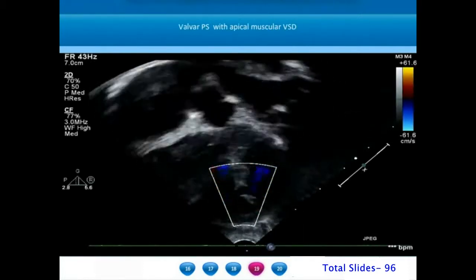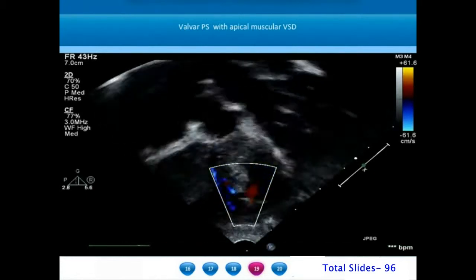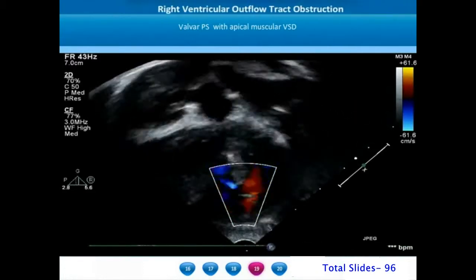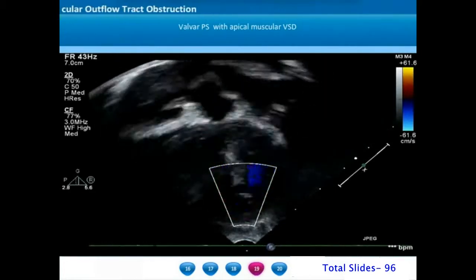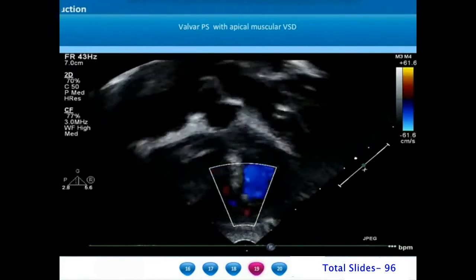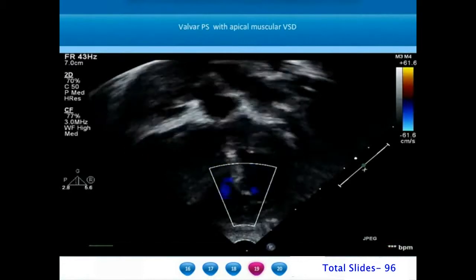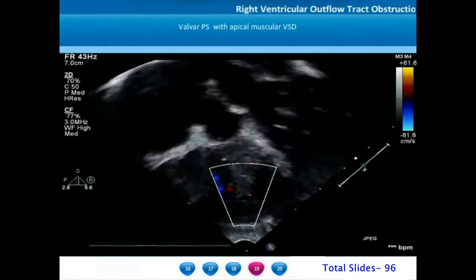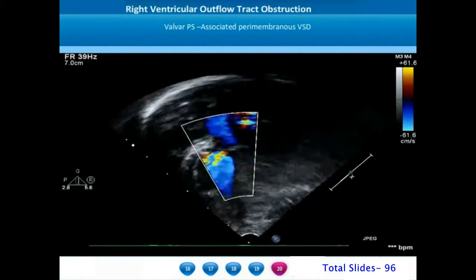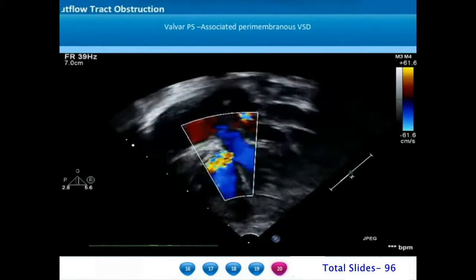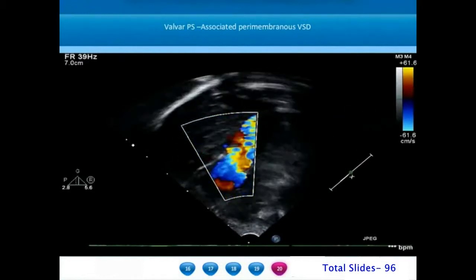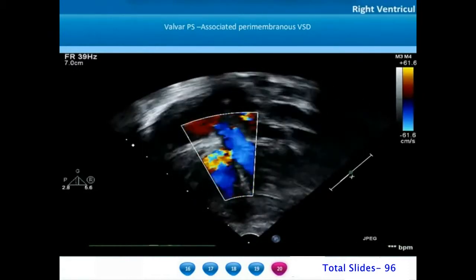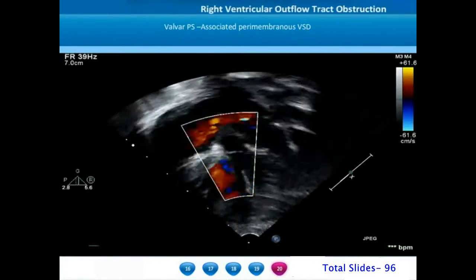One indirect way of assessing severity of pulmonary stenosis is to assess the flow patterns if there is an associated ventricular septal defect. In a patient with valvar pulmonary stenosis and an apical muscular VSD, we appreciate a complete right-to-left shunt from the right ventricle to left ventricle in systole, indicating right ventricular systolic pressure is at least equal to left ventricular systolic pressure. In another patient with a perimembranous VSD, the apical four-chamber view shows left-to-right laminar flow and on anterior sweep we see turbulence across the pulmonary valve.